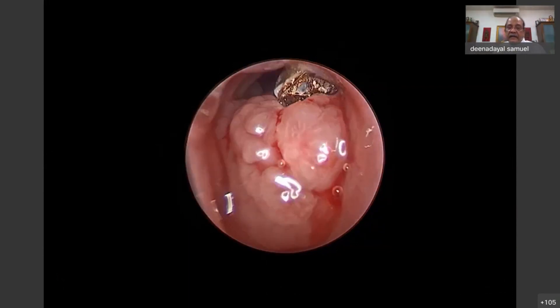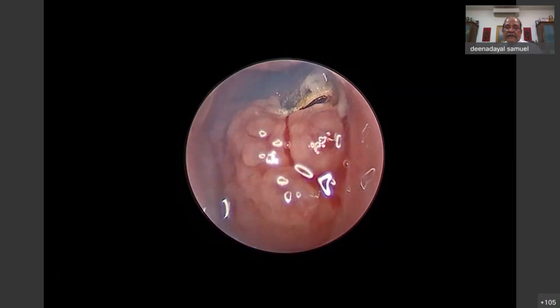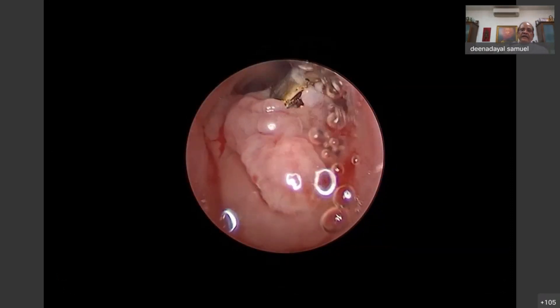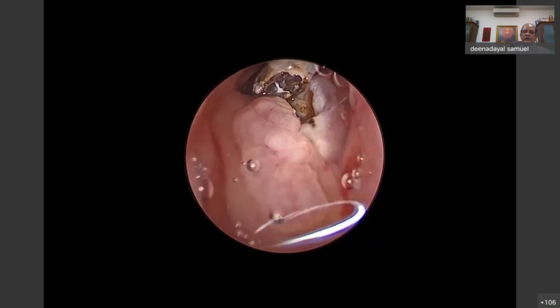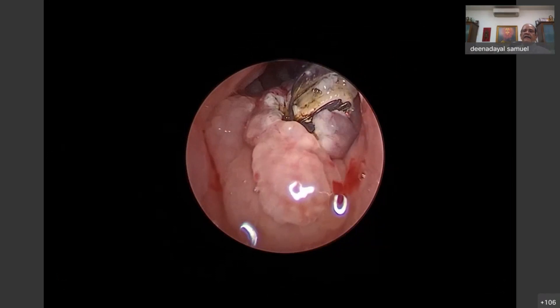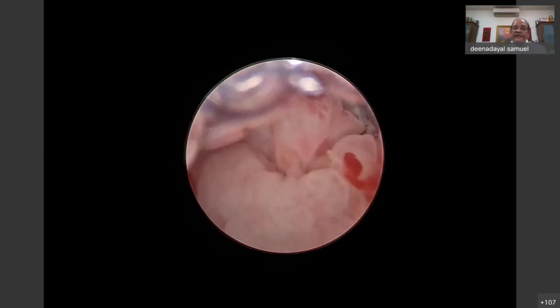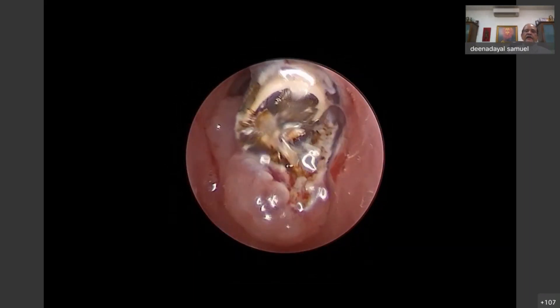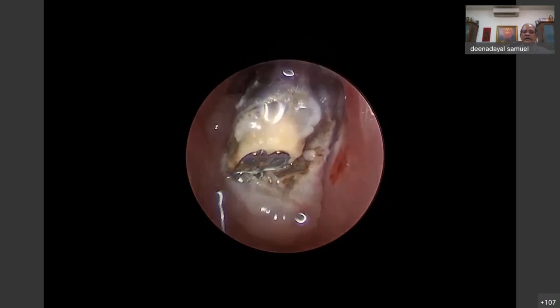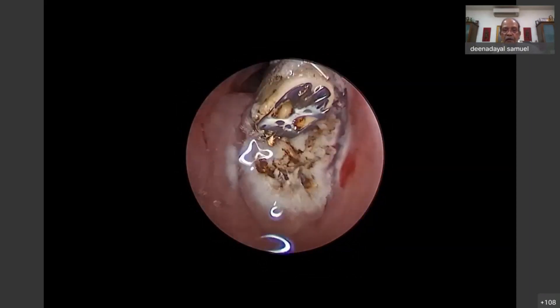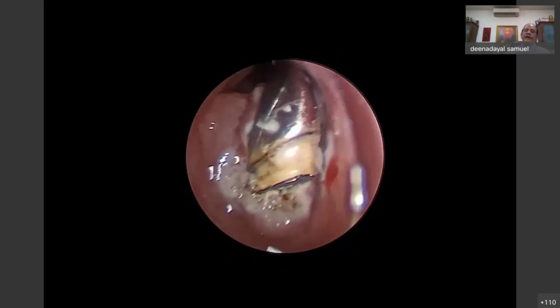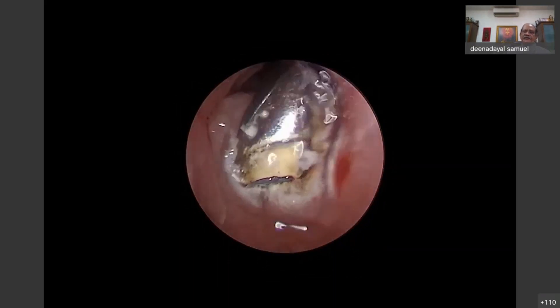A 3mm zero-degree scope is placed transnasally after decongesting, and the adenoid is visualized through the nose — in this case from the left corner. The wand used is a Procise Max wand, which compared to an EVac wand is more aggressive. For removal of the choanal type of adenoid where there is maximum choanal adenoid, this wand is much more helpful than EVac and does a faster job.